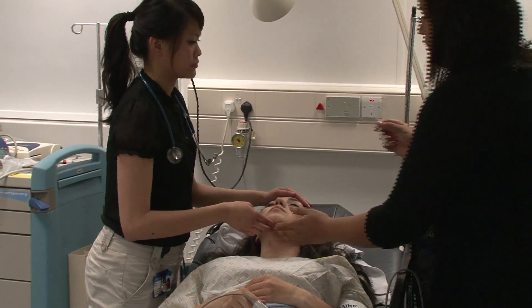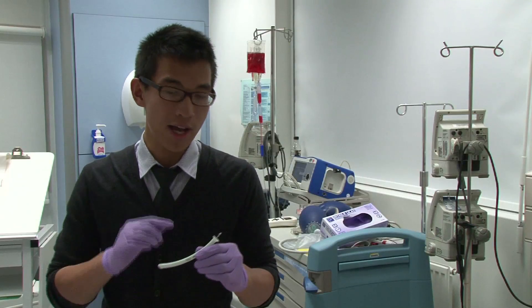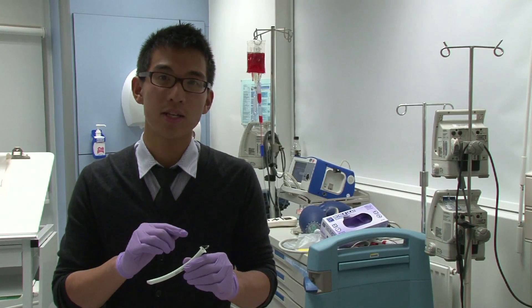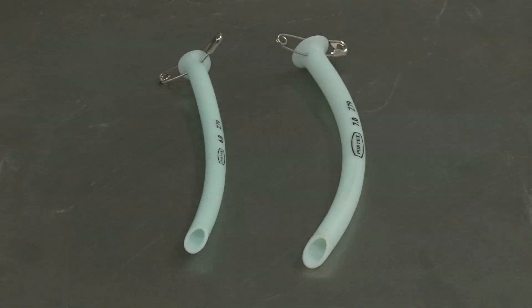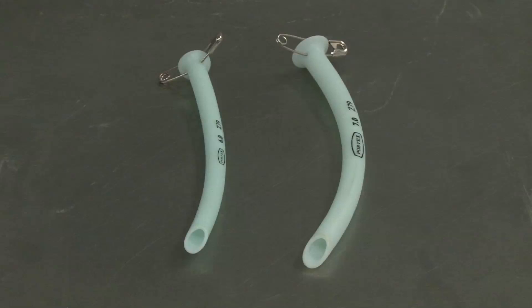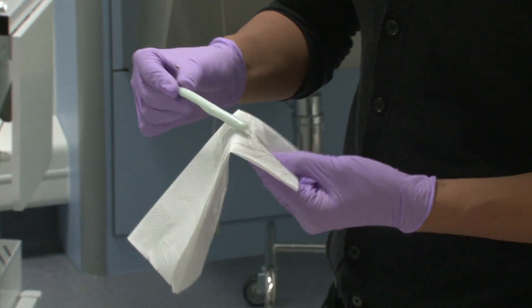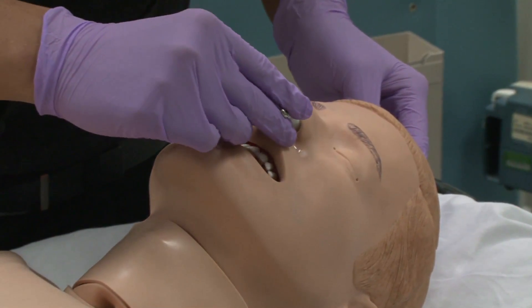Now the nasopharyngeal airway. This is a nasopharyngeal airway, or NPA. One end is flared to limit the depth of insertion. You can also use a safety pin to prevent loss of the airway down the nose. The other end is bevelled for ease of insertion. NPAs are sized in millimetres according to their internal diameter, and the length increases with diameter. Choose the correct diameter based on the size of the larger nostril. The sizes used in adults are 6 to 8 millimetres. Lubricate the NPA before inserting. While inserting, use a gentle twisting motion and aim straight backwards. An important thing to note is that you should not use an NPA if a basal skull fracture is suspected. Signs that suggest this would be CSF leakage from the ears or nose, raccoon eyes, or Battle's sign.